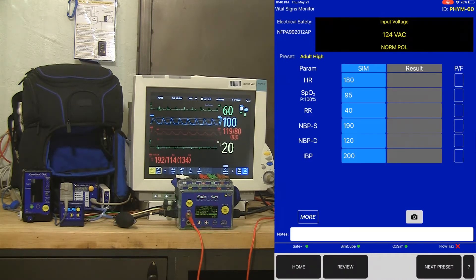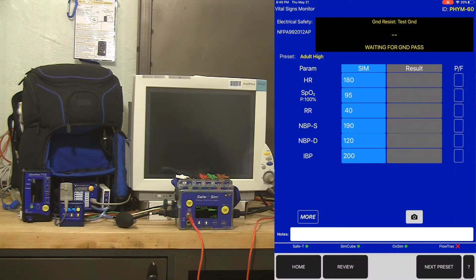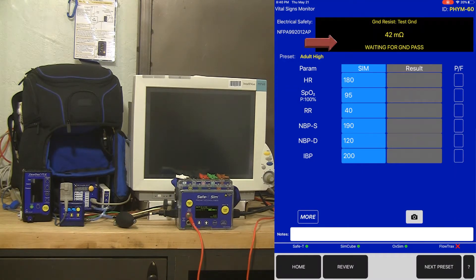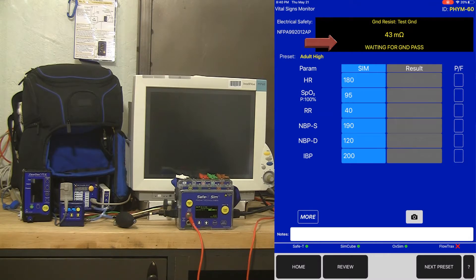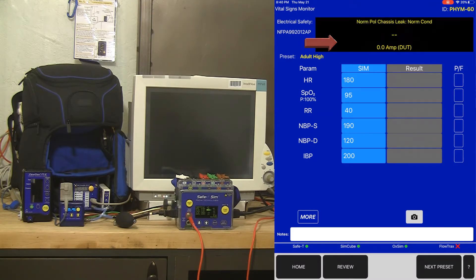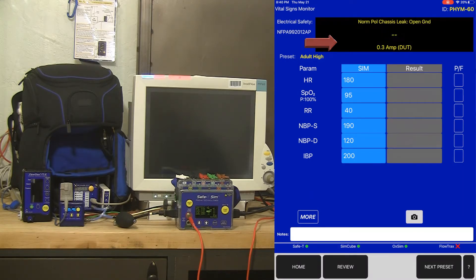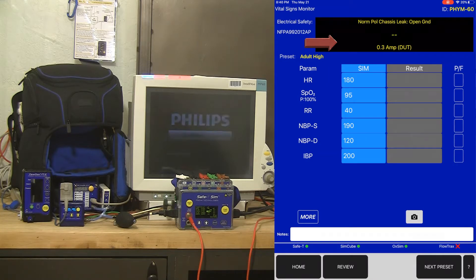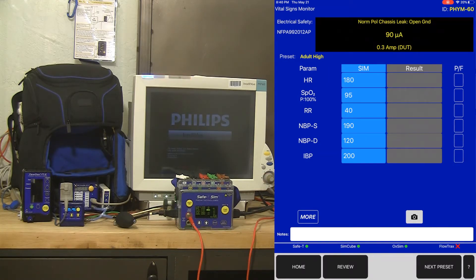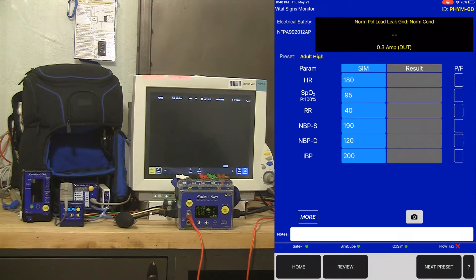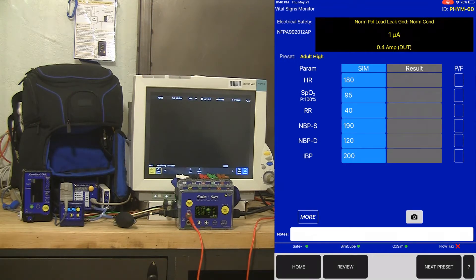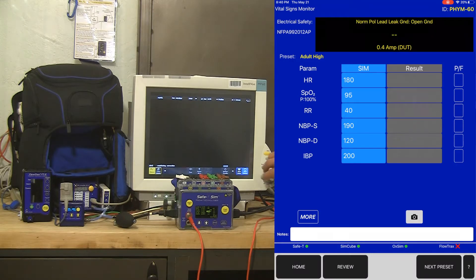So from here, we've already started controlling our test equipment. We've got an electrical safety test started from the iOS device and that Bluetooth connection, and we can actually see real-time the results coming back for that electrical safety test. So just by hitting that start key, we've taken control over all the test equipment that you see here: the electrical safety analyzer, the SimCube NIBP simulator, and the OxSim SPO2 simulator.